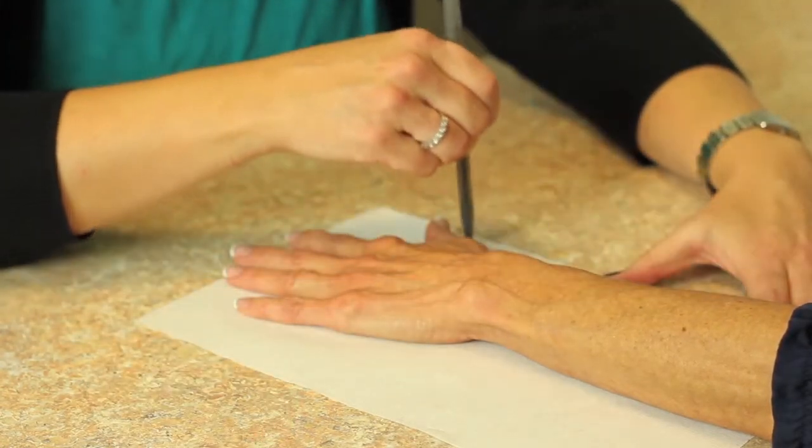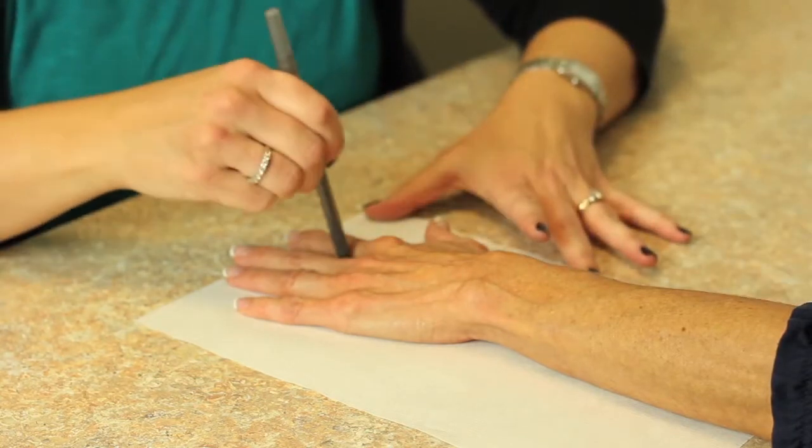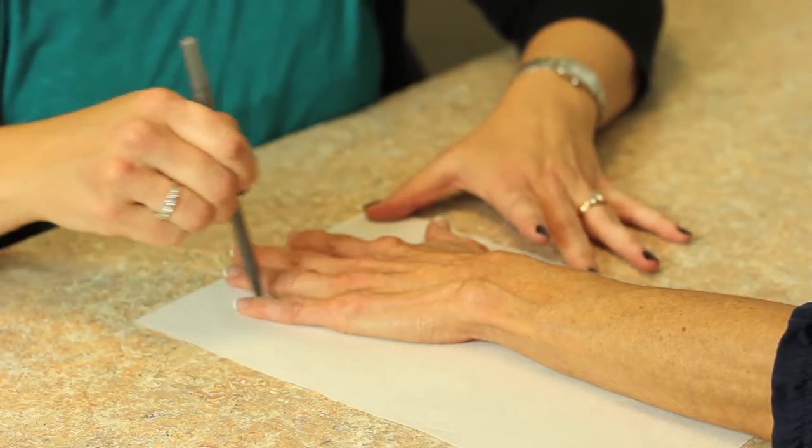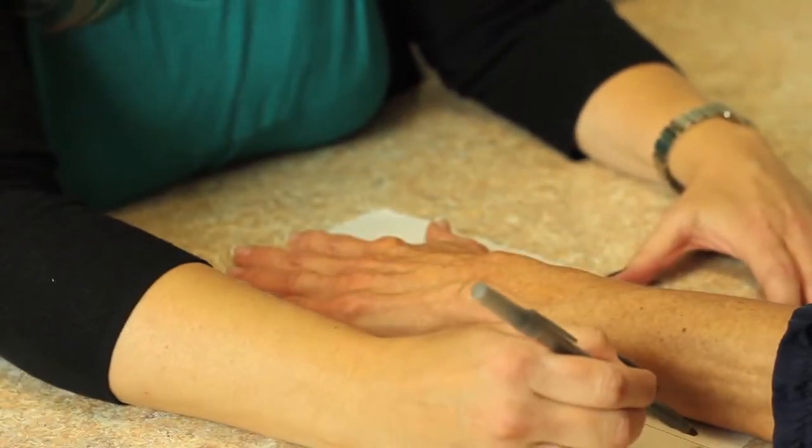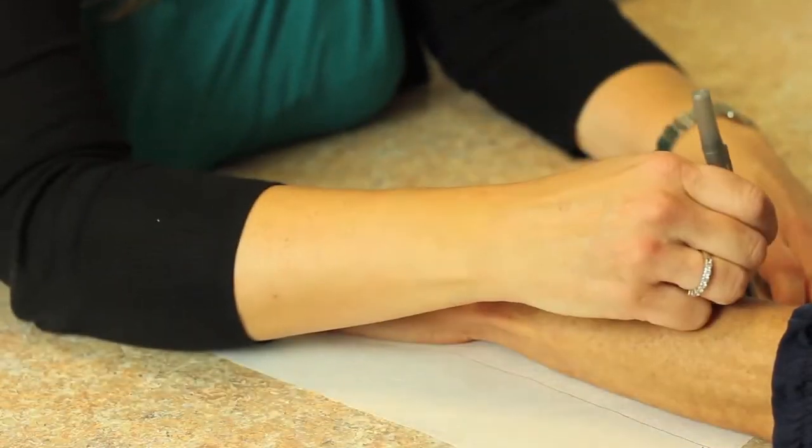To get yourself oriented, just draw out the whole hand. We want to be sure to include two-thirds the length of the forearm so I'm just going to mark up the arm here.